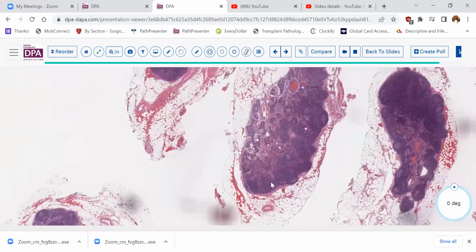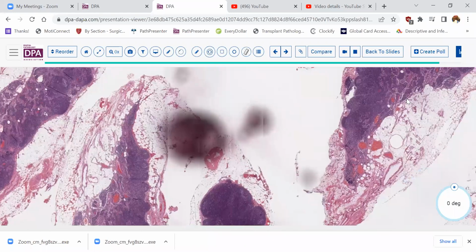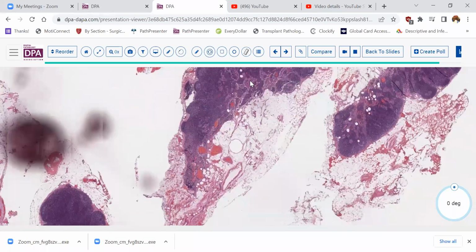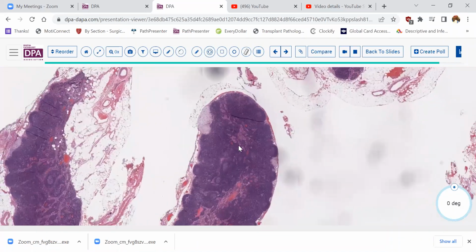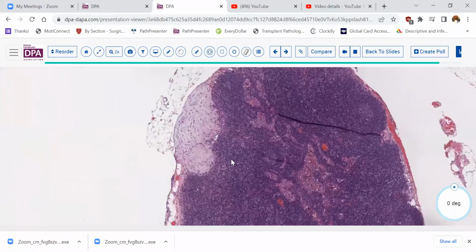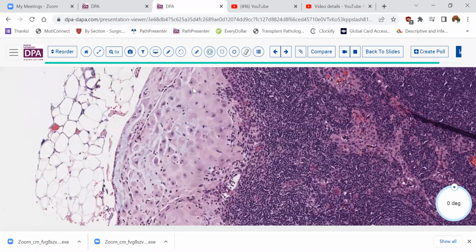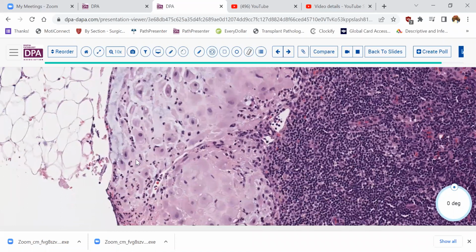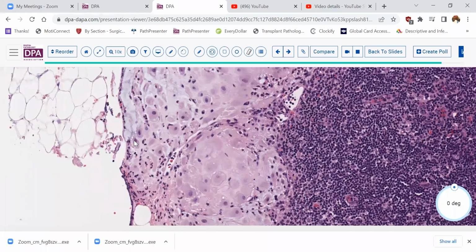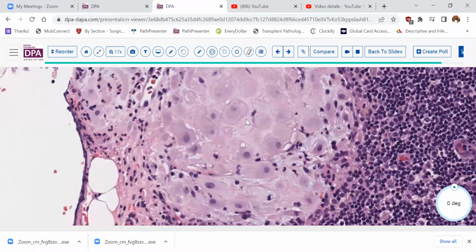And let's see if there are more of them up here. I just don't remember for sure. So several of the sections, and this is just, I think, a single node that was serially sectioned to fully sample it. So these pale areas have a sort of defined cytoplasm. You can see a little bit of intervening myxoid tissue and very characteristic cells with central nuclei and a little bit of atypia maybe to some of these cells.